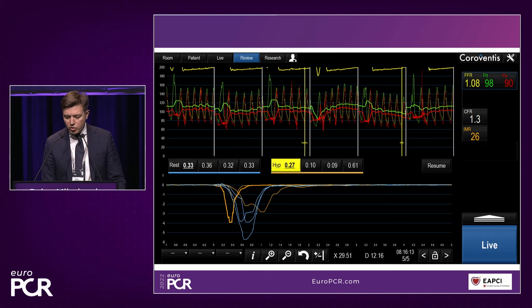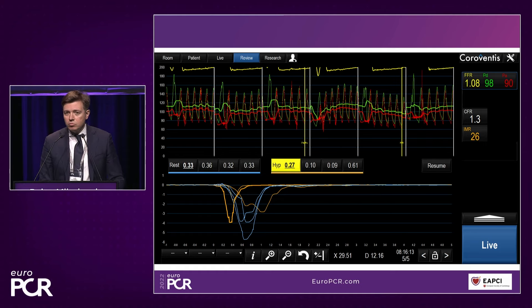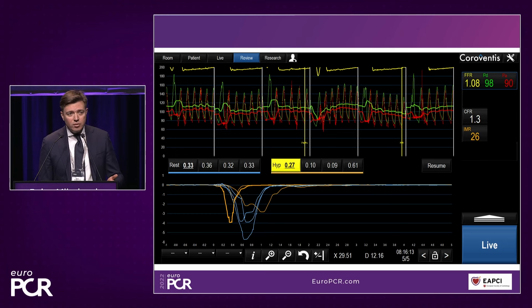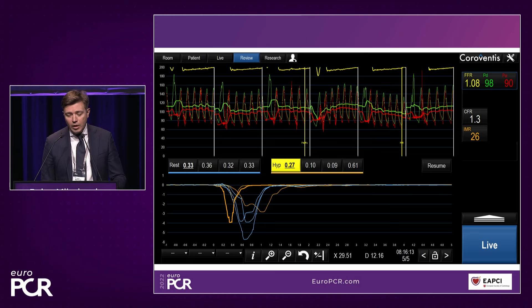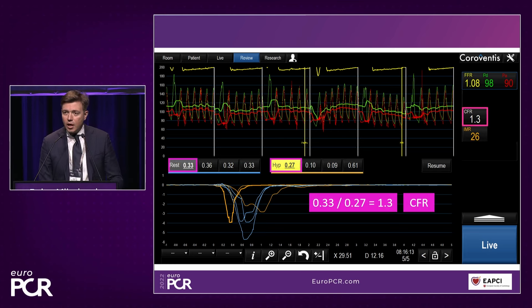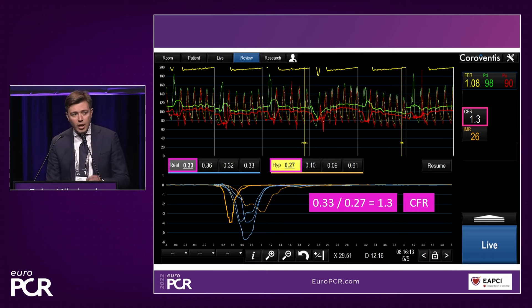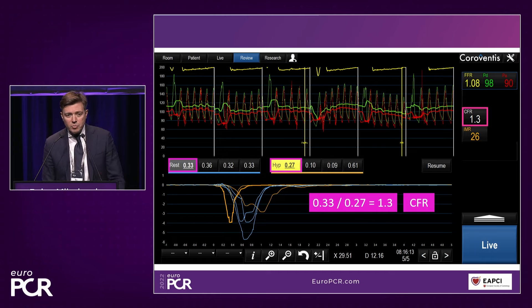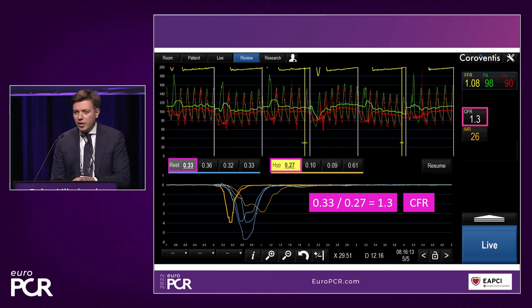The results were CFR 1.3 and IMR 26. We thought this explained everything — chest pain on exertion, young female, slightly overweight, CMD diagnosed. However, looking closely at how we got these values: mean transit time at rest was 0.33, divided by hyperemic mean transit time of 0.27 gives CFR 1.3. For IMR, we multiply distal coronary pressure by hyperemic mean transit time. But we should not stop at just numbers — we need to look at the thermodilution curves themselves.